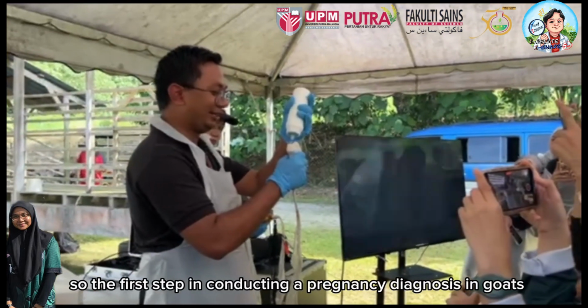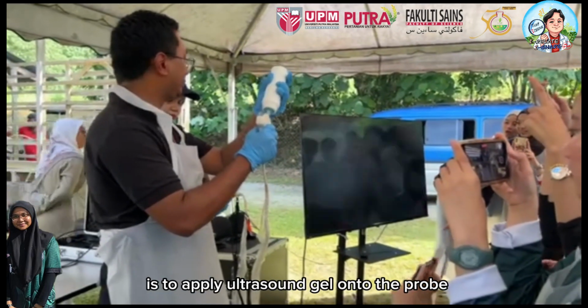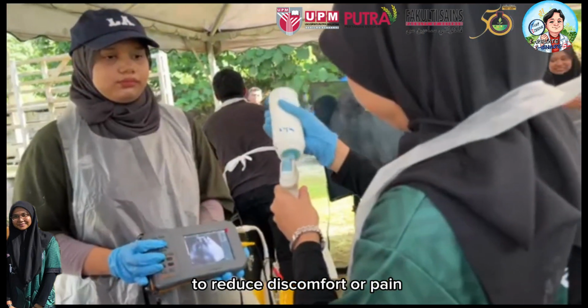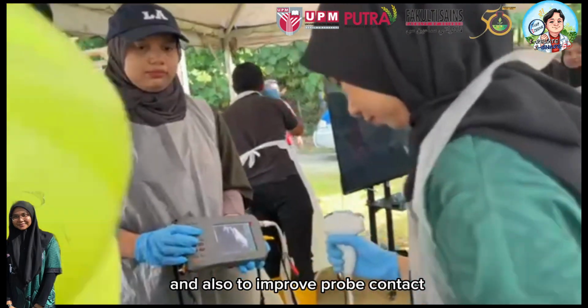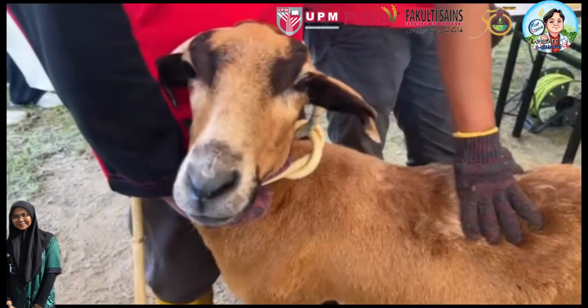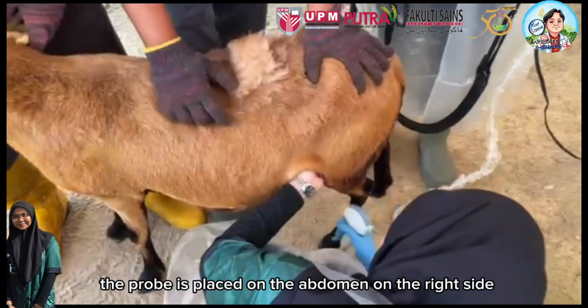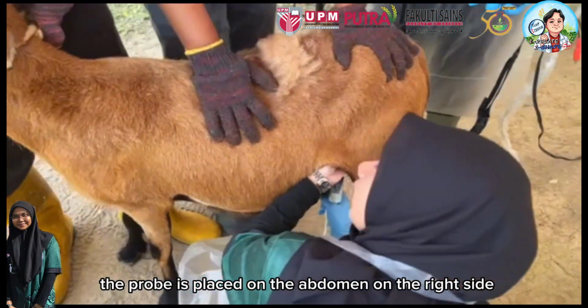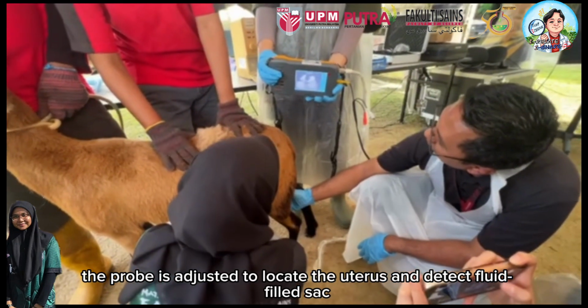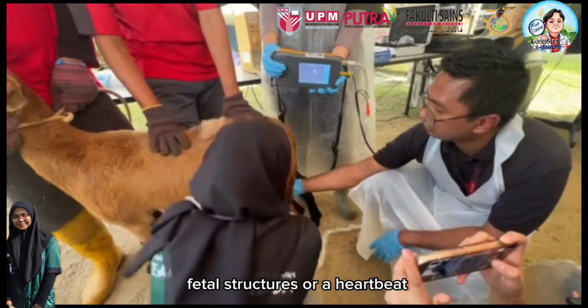So the first step in conducting the pregnancy diagnosis in goats is to apply ultrasound gel onto the probe to reduce discomfort or pain and also to improve probe contact. The goat is restrained properly to minimize stress. For the transabdominal method, the probe is placed on the abdomen on the right side near the udder. The probe is adjusted to locate the uterus and detect fluid-filled sacs, fetal structures, or a heartbeat.